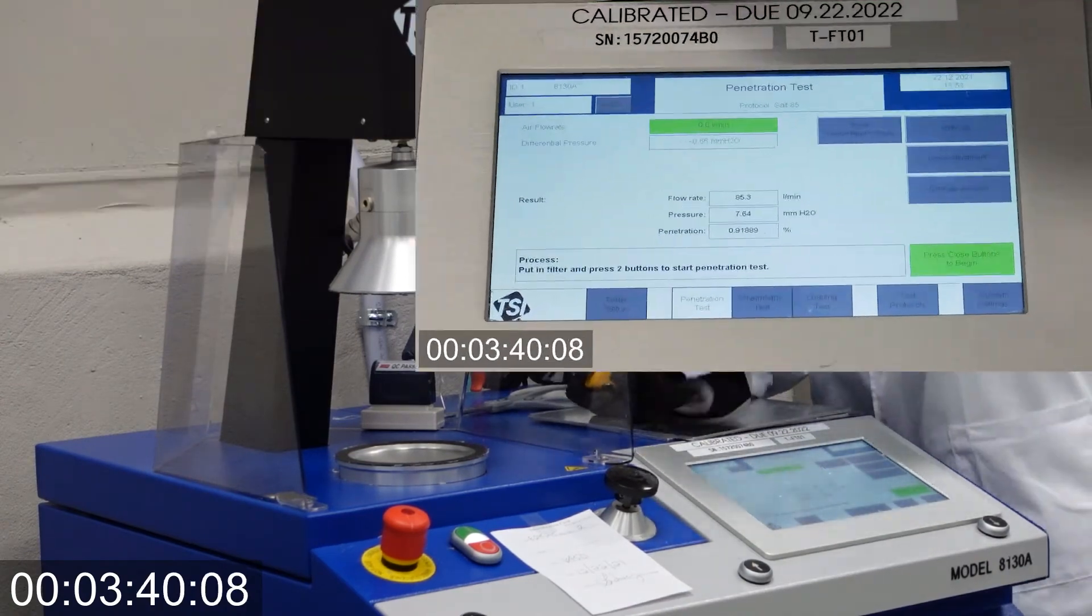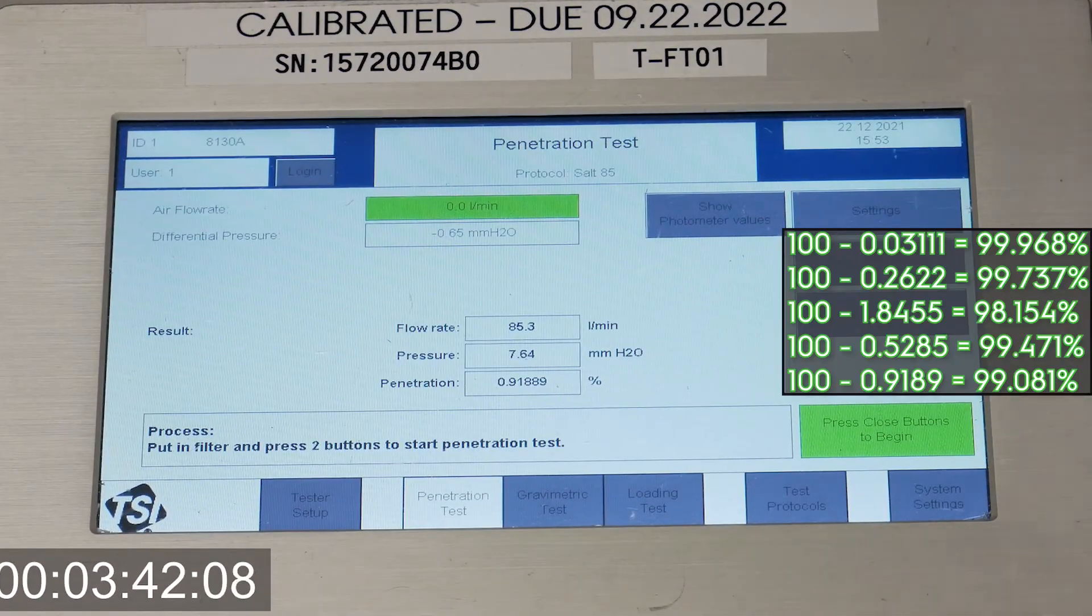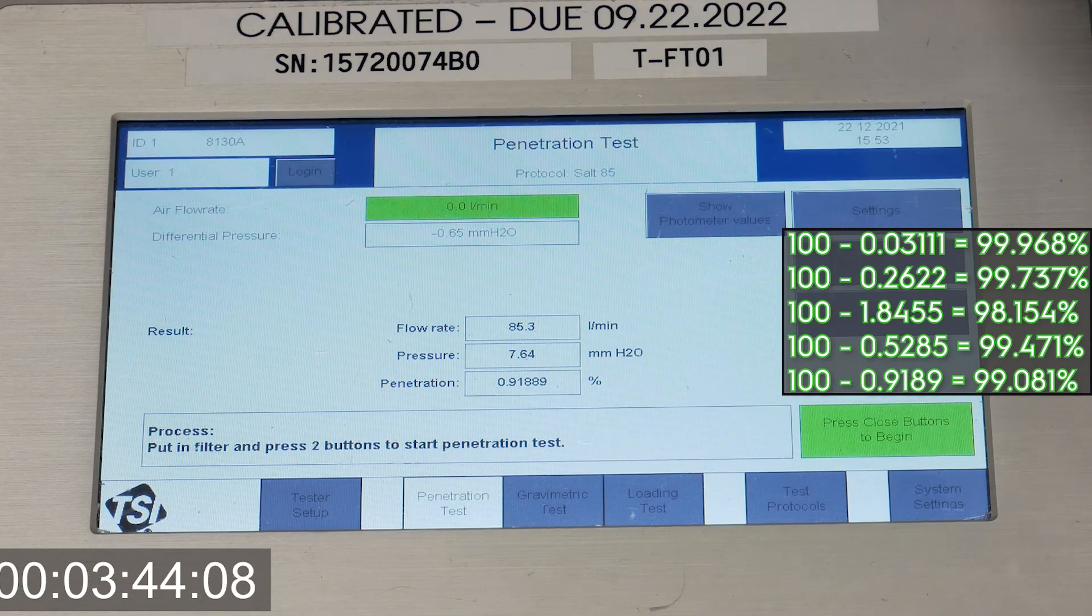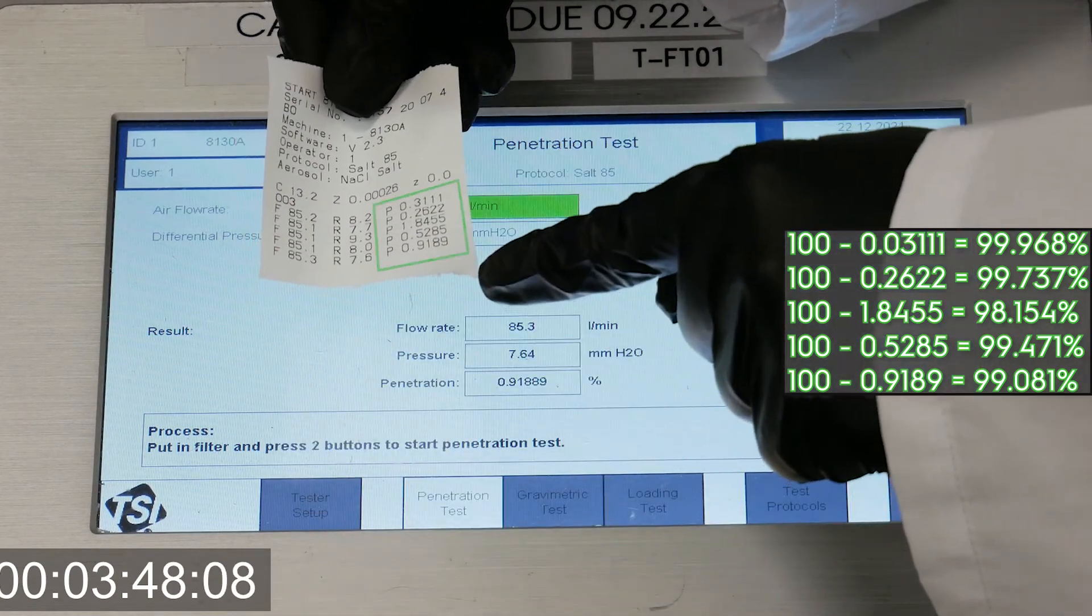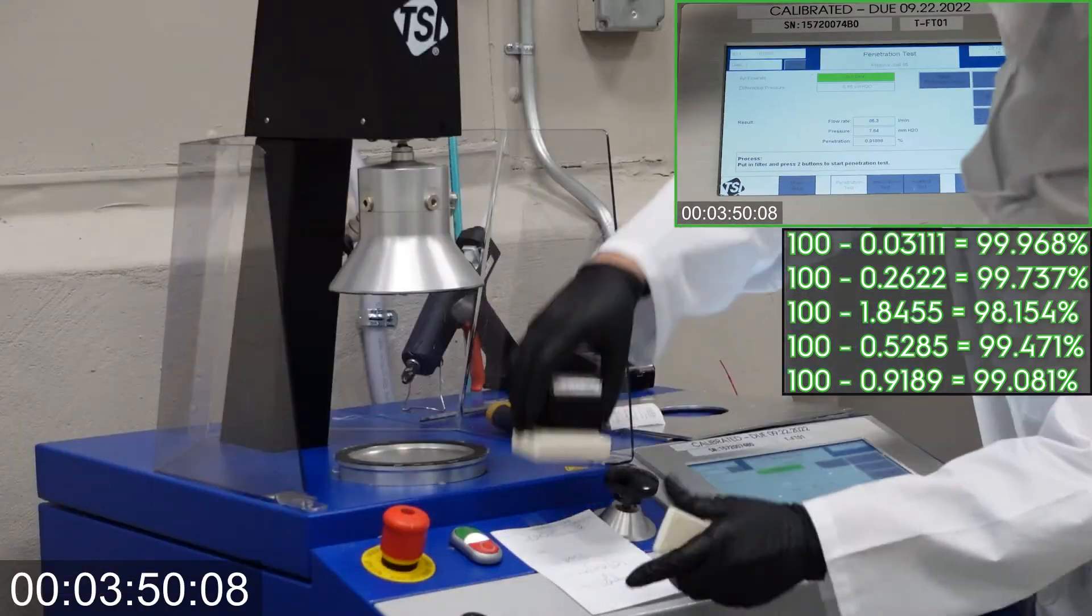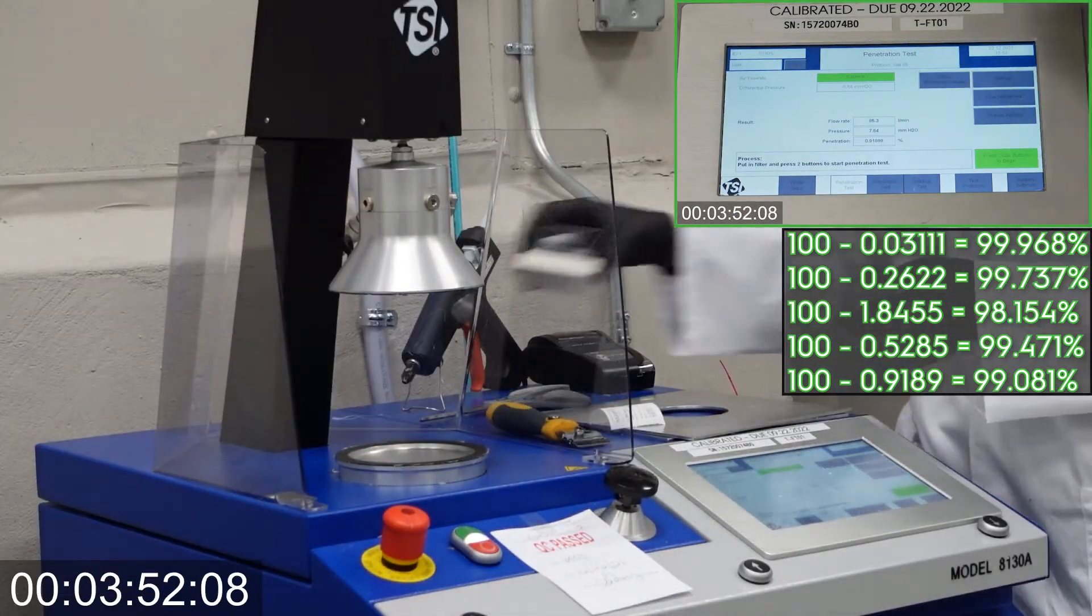Well folks, there you have it. Our masks and respirators tested less than 1-2% for particle penetration, which means 98-99% filtration efficiency.